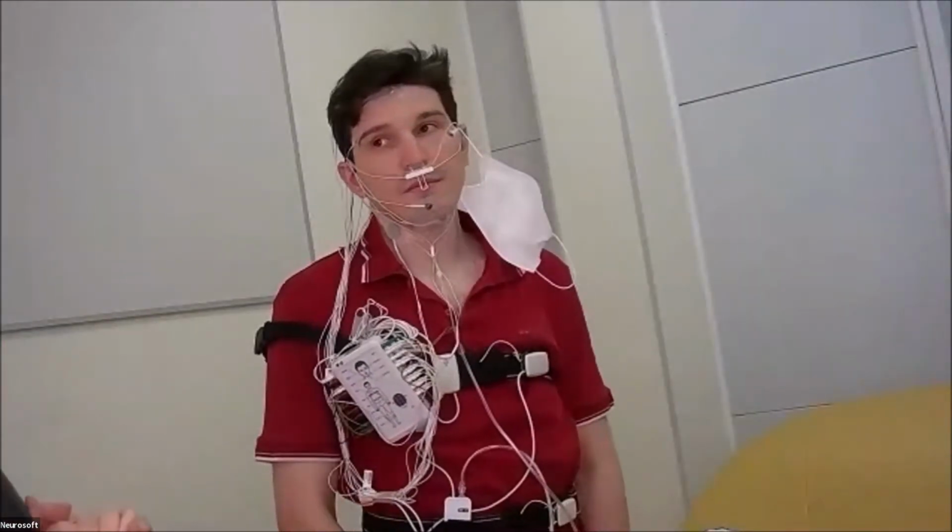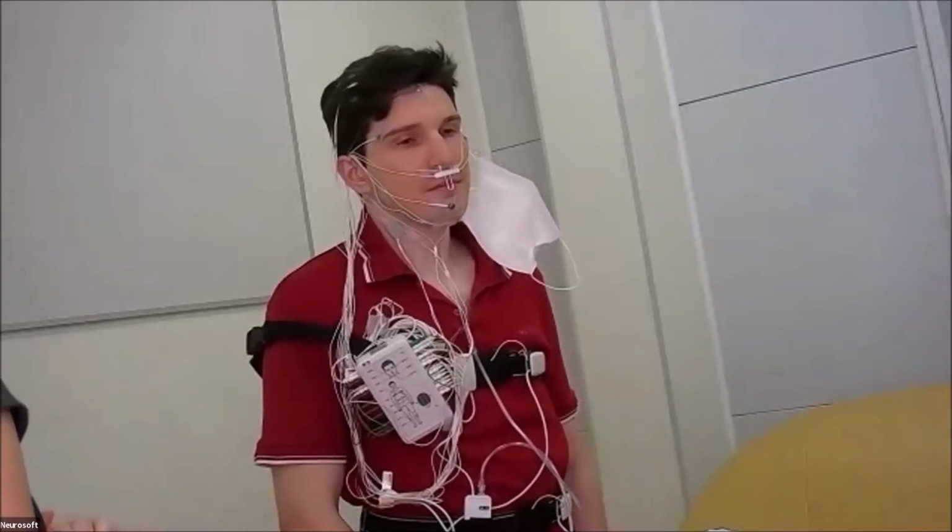So we put two sensors on the patient's face. But in some cases, we can use one sensor, either the thermistor or the cannula, and in this case, this one sensor would be used for the detection of apnea and hypopnea events. So this is the first, very main channel for respiratory monitoring.